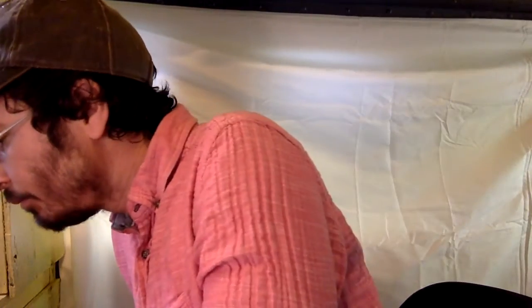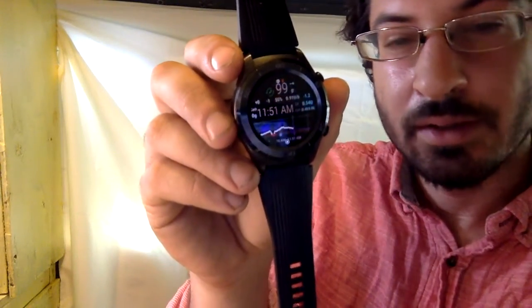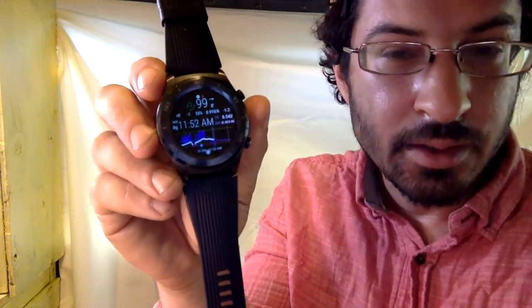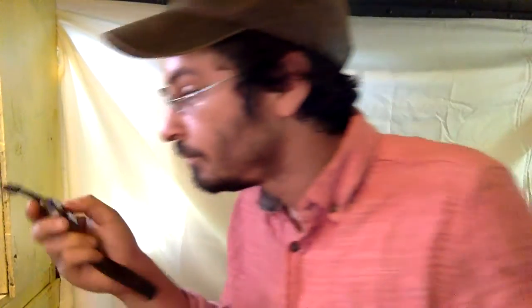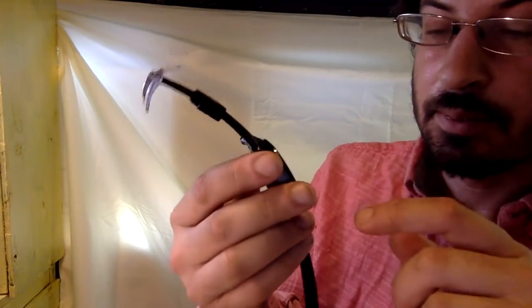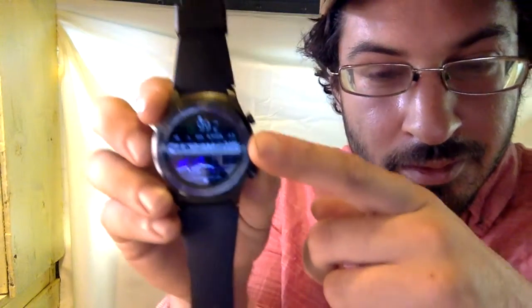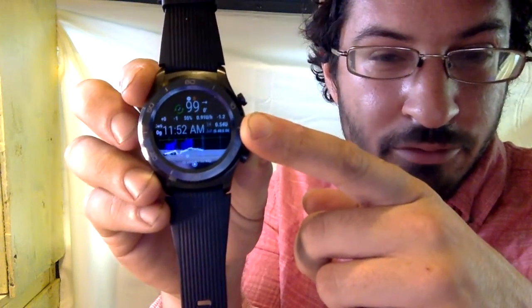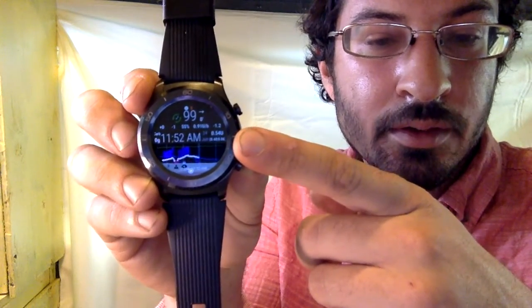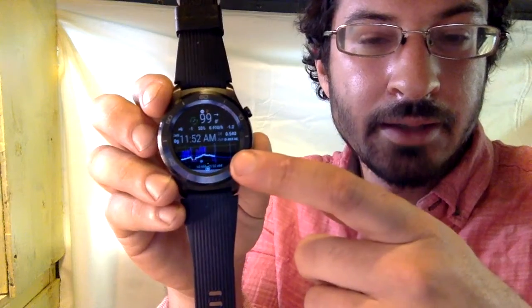The 0.91, it died already, that's fast. The 0.91 is my basal rate, so that's not the total insulin on board. The IOB, the amount of insulin on board, is over here, 0.54. Carbs in my system, carbs on board. And then I've got the graph.